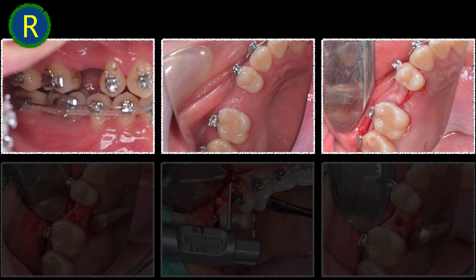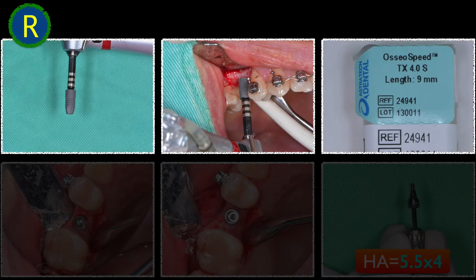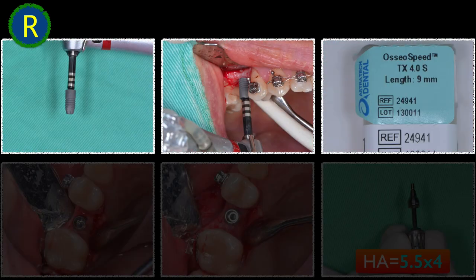Step by step: we make an incision and raise the flap. After raising the flap, I check the thickness — it's exactly like what we saw in the slice view, 6 mm. We drill right in the middle of the ridge, and hopefully we'll have enough thickness for the buccal bone. We place the indicator, take an X-ray, check parallelism, and find out we have a little bit of labial bone — about 1.5 mm. Ideally I would love 2 mm, but nothing is perfect, so 1.5 mm is acceptable.